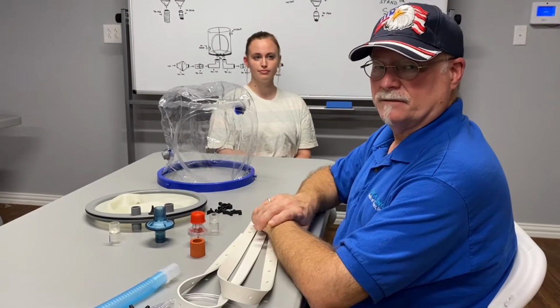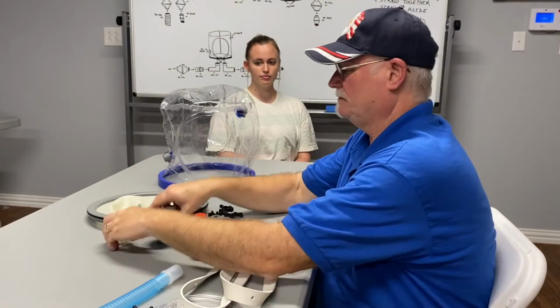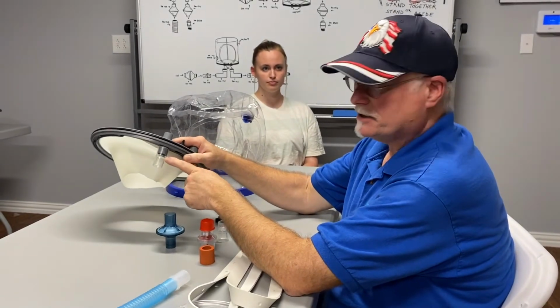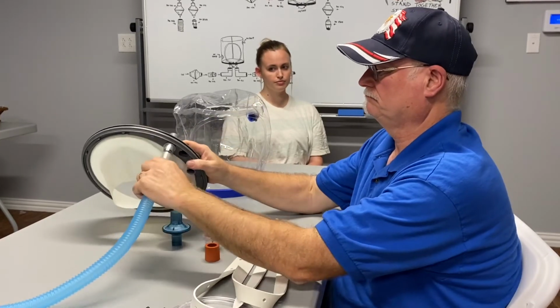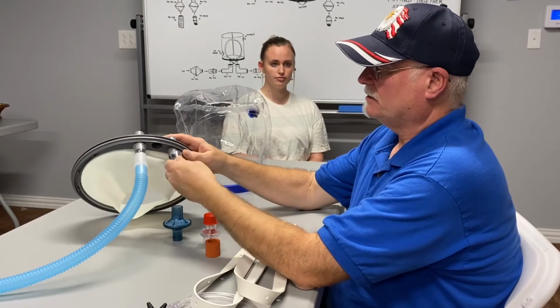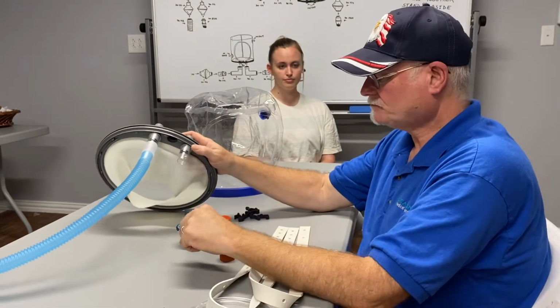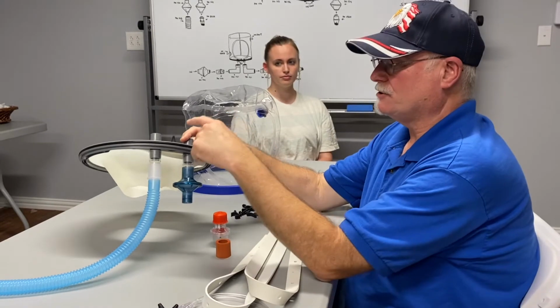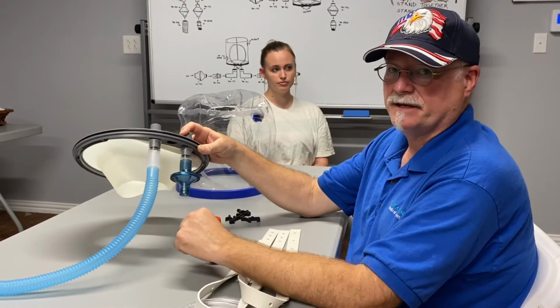Now we're ready to assemble all the accessories onto the neck seal. First we start with the inflow port. And something you really want to be sure of is you have the right one in the right direction, because it has to only flow one direction, in and out. Next we're going to put the adapter on here, the one-way valve that goes one direction. Bacterial viral filter, that ensures that any of the gases coming out of the hood from the patient are sterile and not escaping into the atmosphere.